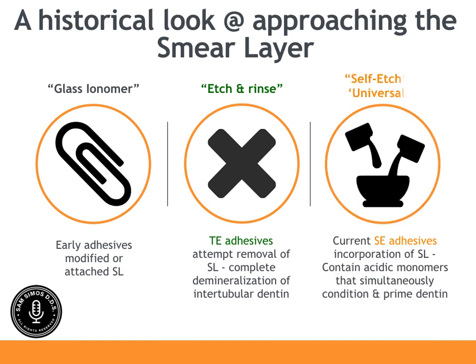So now we've come to the current self-adhesive adhesives, which are self-etch. We've removed the etch step and incorporated it into the smear layer, and that creates a simultaneous diffusion into the dentin, and it creates a nice situation. We're going to talk a little bit about that, but historically we've treated the smear layer very differently depending on what kind or generation of adhesive we use.